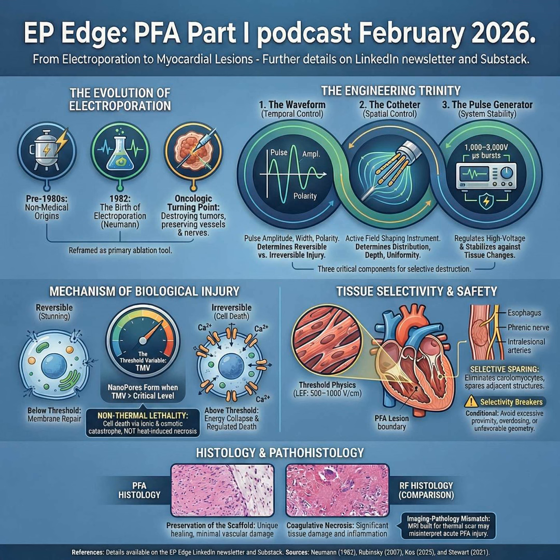That event was a proof of concept. Electrical energy delivered through a catheter could permanently modify conduction tissue. Over the next few years, that translated into deliberate DC ablation efforts, including early animal work, and then human procedures targeting AV conduction and accessory pathways. But DC ablation had major limitations. It was painful. High voltage meant arcing and explosive gas formation, and the shockwave effects weren't trivial. Ventricular arrhythmias, hypotension, even perforation.